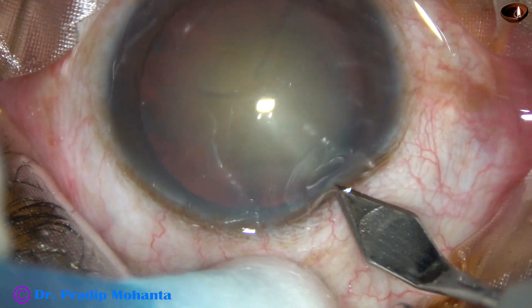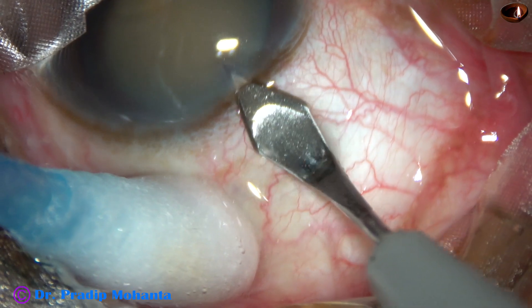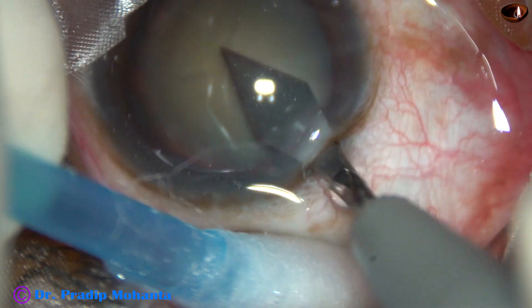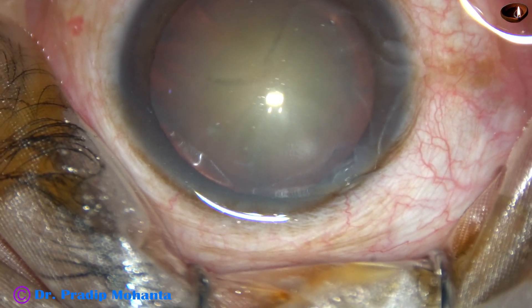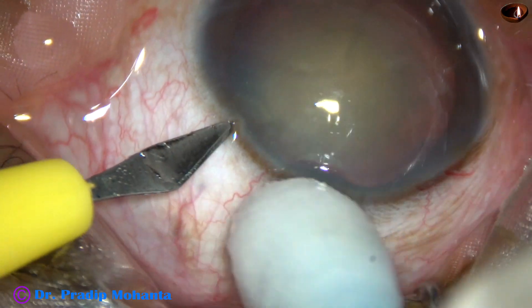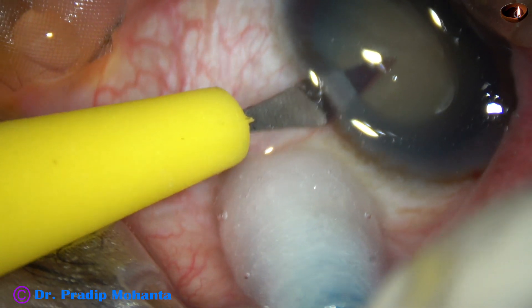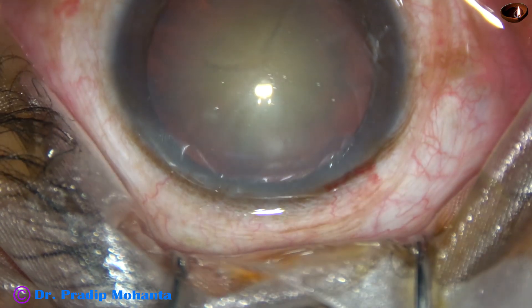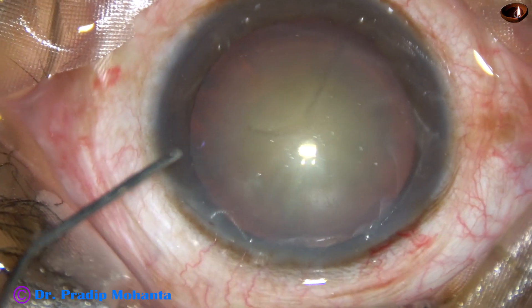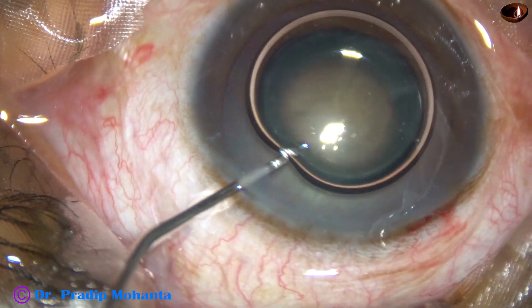This is the main incision on the posterior aspect of the limbus with a 2.8 mm steel keratome. This is a side port on the left side of the main incision, about 3 o'clock hours away. An air bubble is injected.